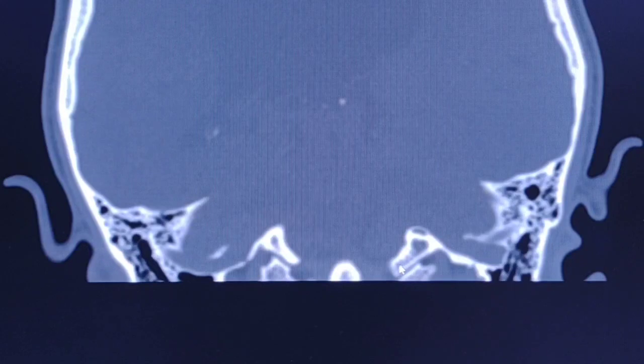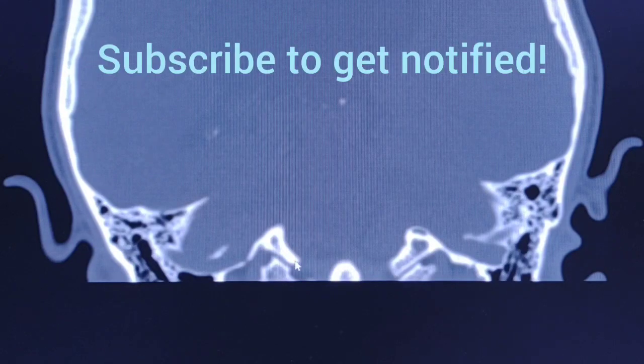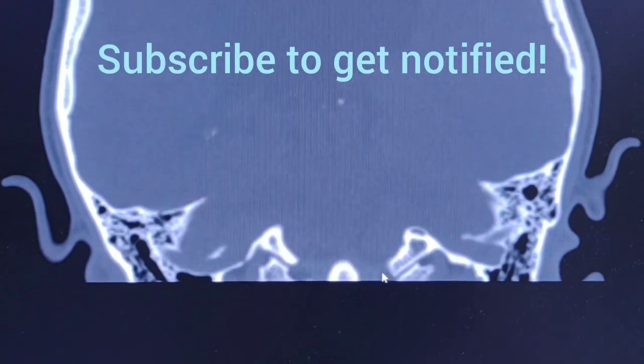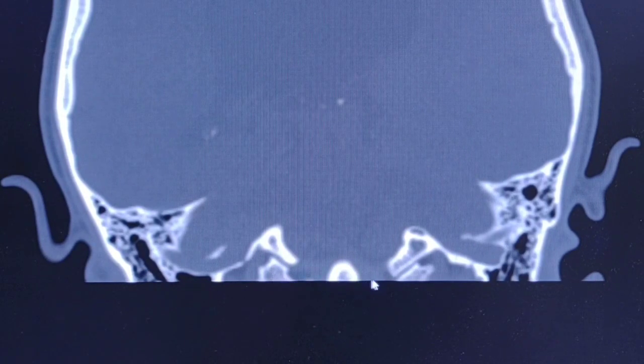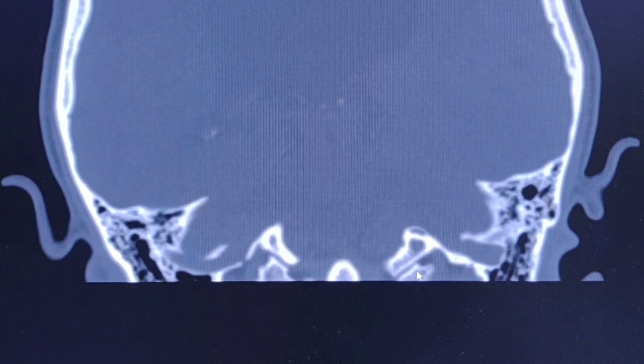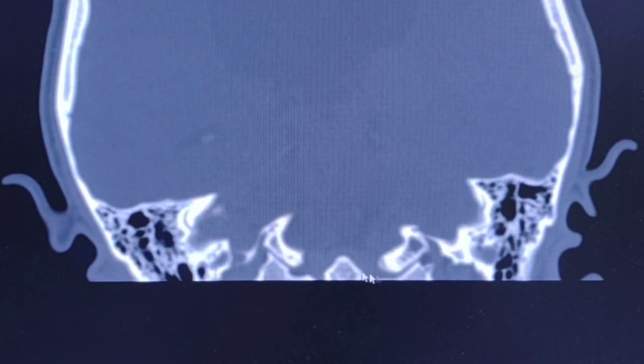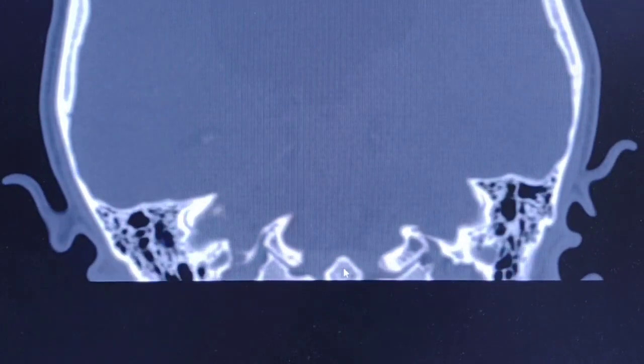Just keep in mind that here is the foramen magnum and here is the odontoid process of the C2 vertebra. This is the C1 vertebra, the atlas, and here is the odontoid process of C2. Let's have a closer look.